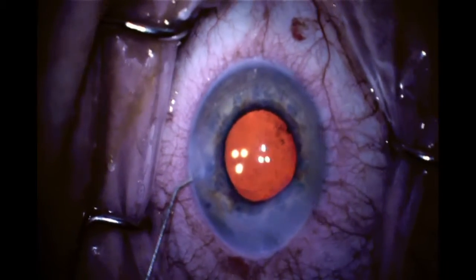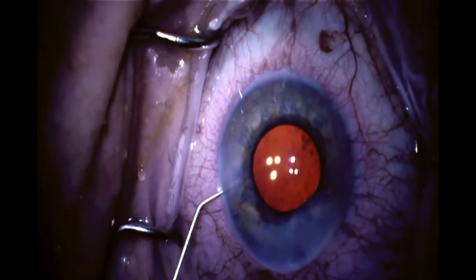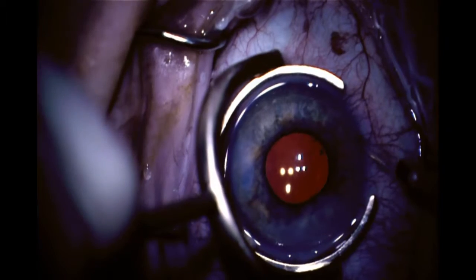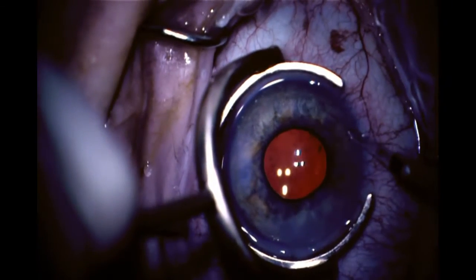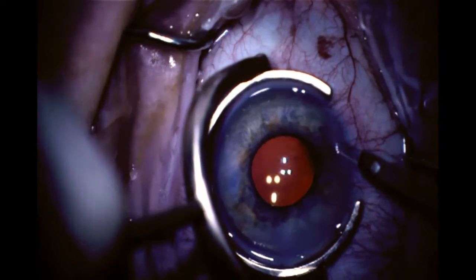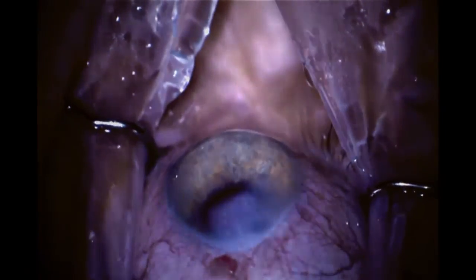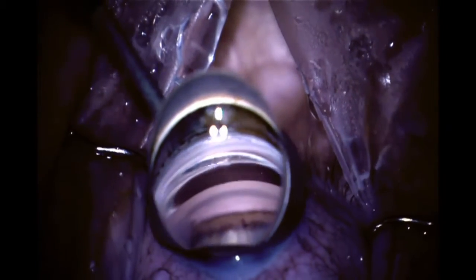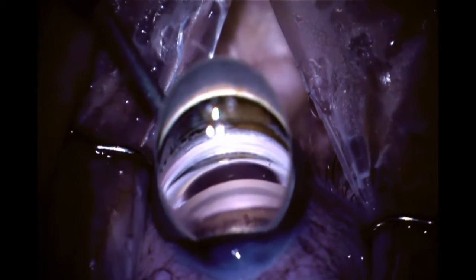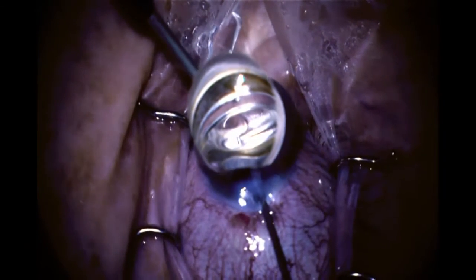We then inject myostat to bring down the pupil and begin the ab-interno-canaloplasty. I'm making an oblique paracentesis directed towards the nasal angle that is superior to allow easier assistance from my staff. I then rotate the head away from me while I rotate the microscope oculars towards me to better visualize the nasal angle structures. Here I'm using a gonioprism to visualize and confirm that I can see the angle structures. I then enter with an MVR blade, inserting it and bringing it across the anterior chamber before placing my gonioprism.